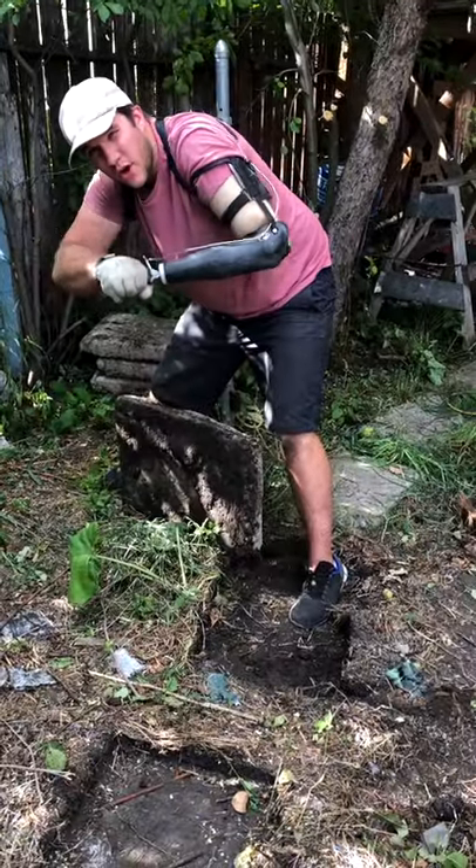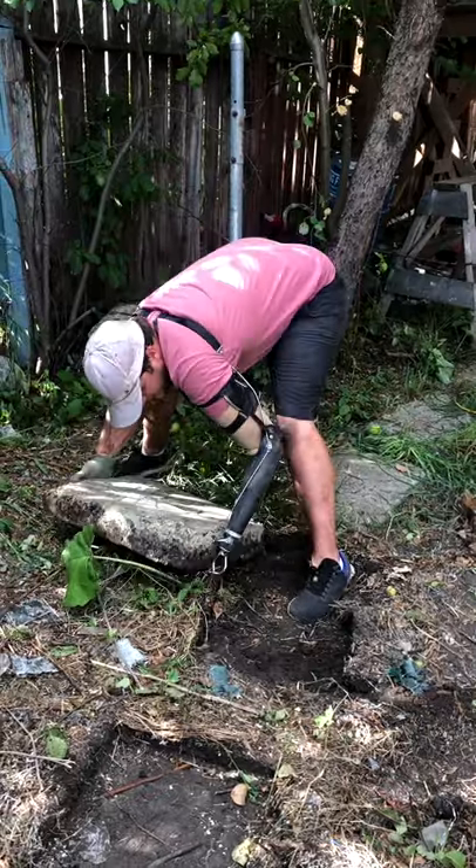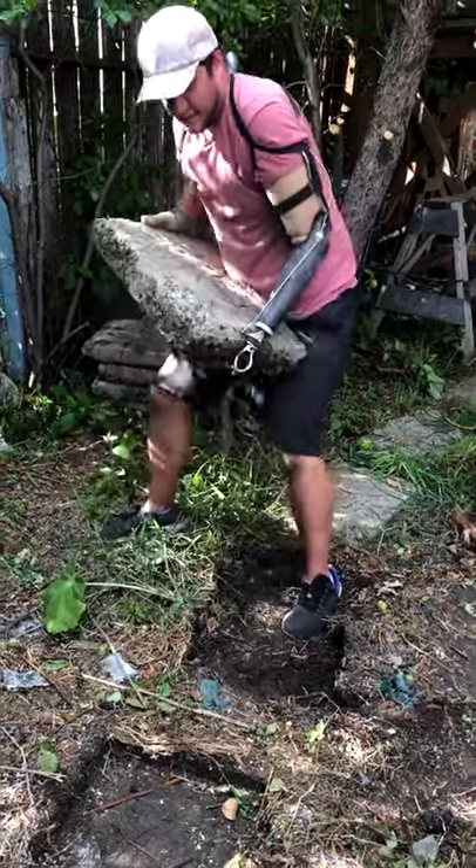It's also really strong tension-wise, so I can still lift even this big block of cement with my hook.